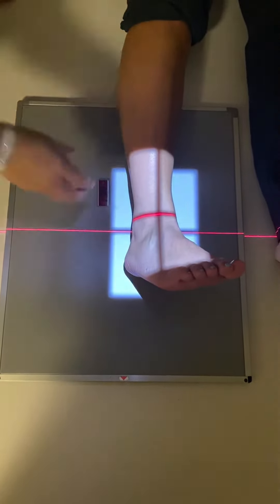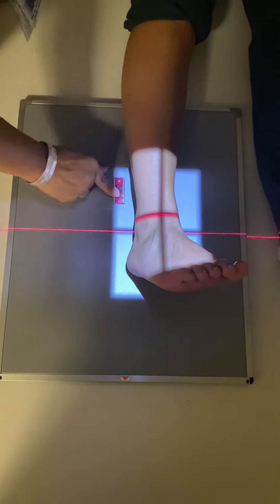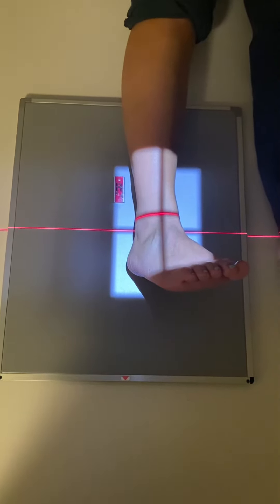You might have to open up your width just a little bit to get the right marker in there. And that's your Mortise ankle.